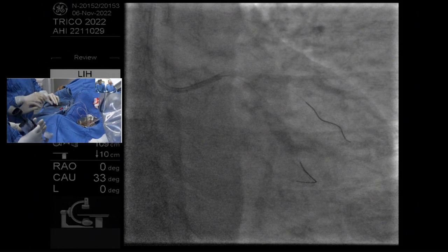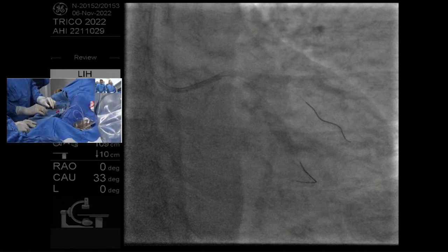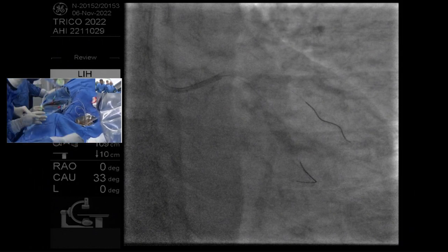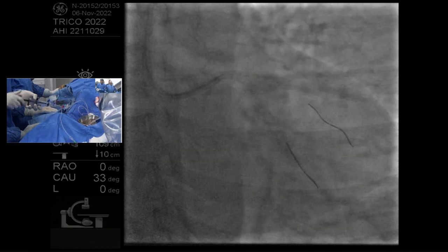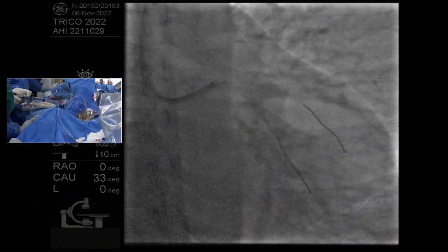And so when you're on the wire, just before you put it inside the body, take that balloon up to 10 atmospheres. But the key is it's on the wire. If it's not on the wire, it will collapse the internal lumen, and then it becomes a real pain to put it on the wire. So take it to 10 atmospheres outside the body, so you're intentionally winging it and making it larger. Yeah, and then bring that down.